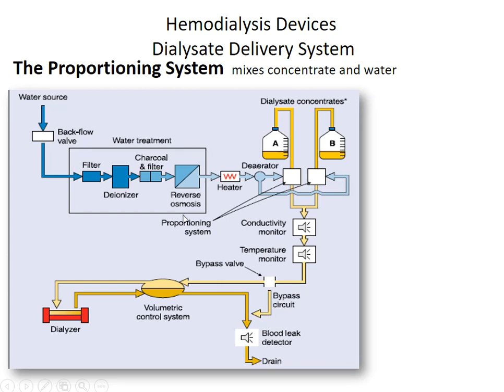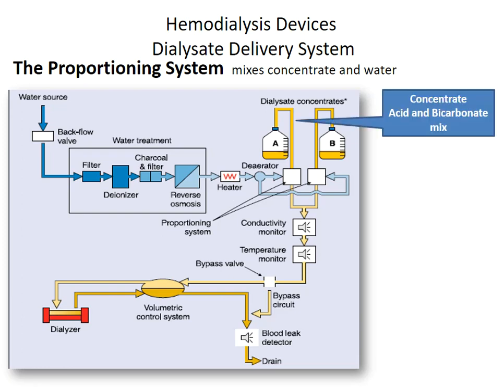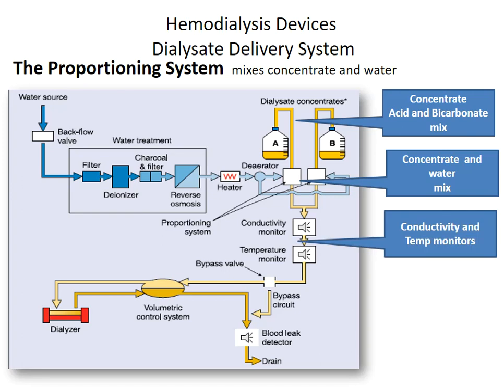Water inflow from the water treatment system passes through a heater, then is mixed with a concentrate of an acid and a bicarbonate. Then we have a concentrate and water mix, which passes through the conductivity and temperature monitors.